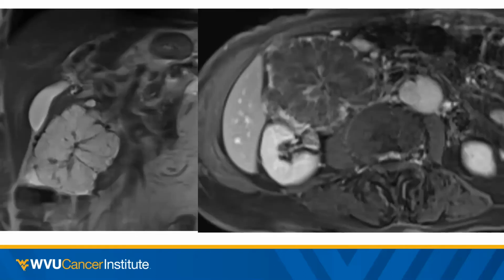And here's just the same patient, but corresponding MRI imaging. On the left-hand side of the screen is the T2 weighted imaging, where we see the microcystic growth pattern, where we have increased T2 signal, but you notice it's not quite as bright as the adjacent gallbladder, which contains more simple fluid. The central scar is of low T2 signal. And on the right-hand image, this is a post-contrast image where we can see that the majority of the mass is hypoenhancing, but the central scarring is of delayed enhancement.